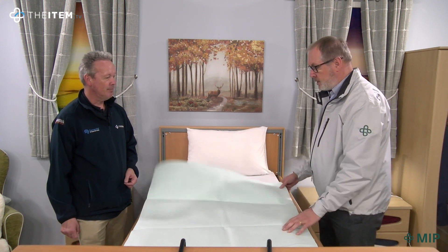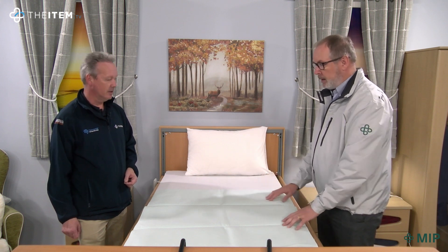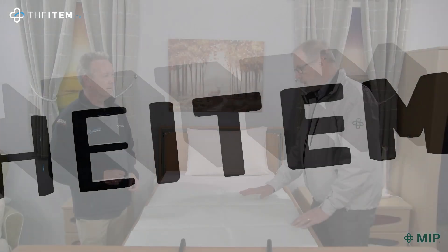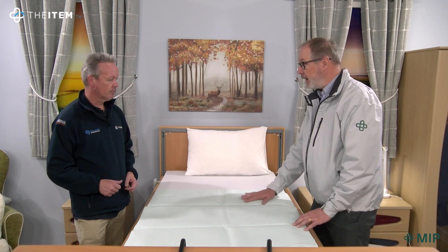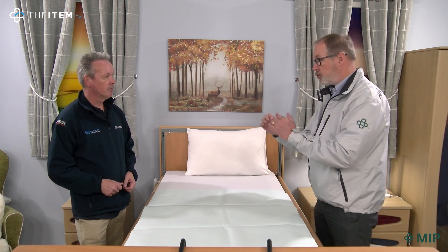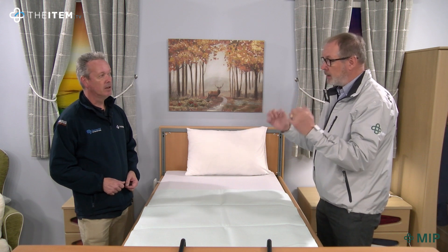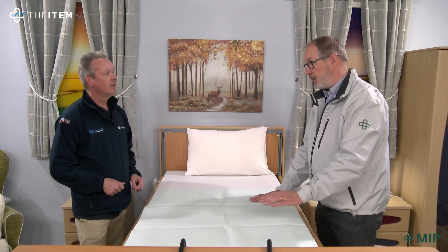It comes without tucks because there's no need for them. It's very much the next generation of bed pads. When moisture is absorbed into it and someone sits or lies on it, the construction allows the fluid to wick away from the pressure point, leaving a far drier surface than a traditional bed pad.